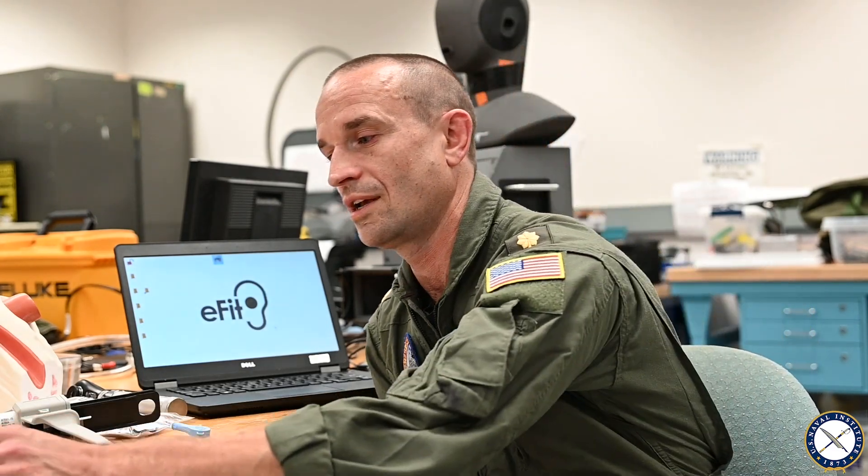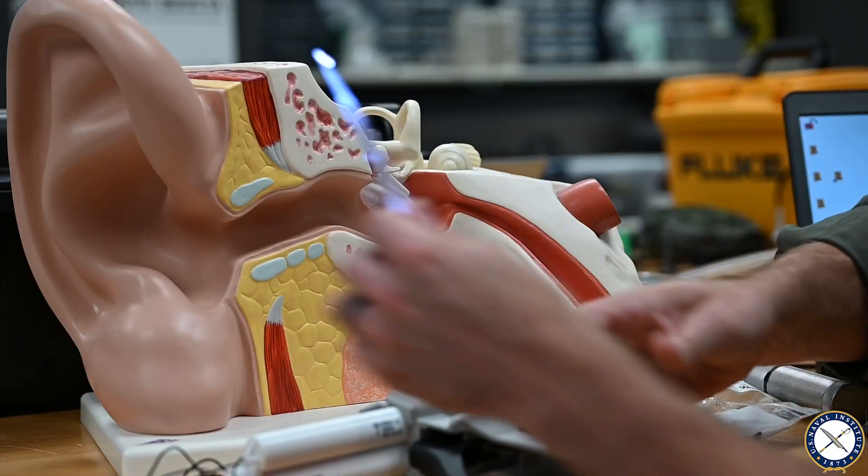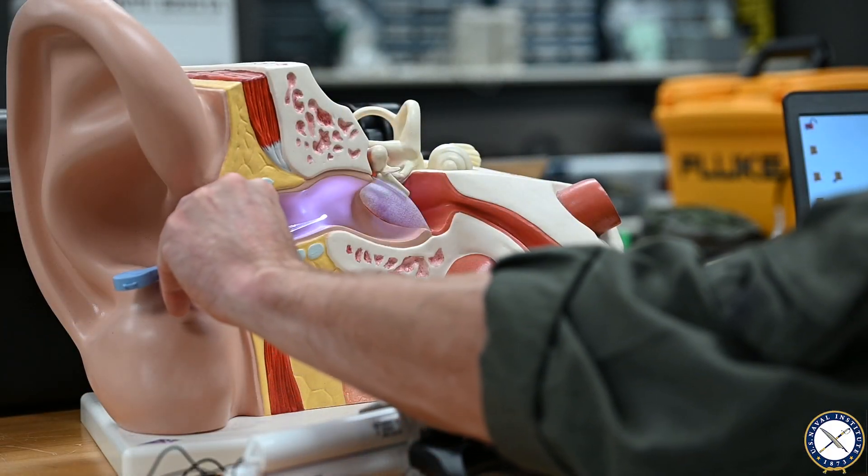I just demonstrated two different impression methods for creating custom ear protection. One is the legacy-based method where we take silicone-based material and create a physical impression. It involves placing an oto-block in the ear canal deep enough to get quality hearing protection performance, both regarding depth and quality of the impression.